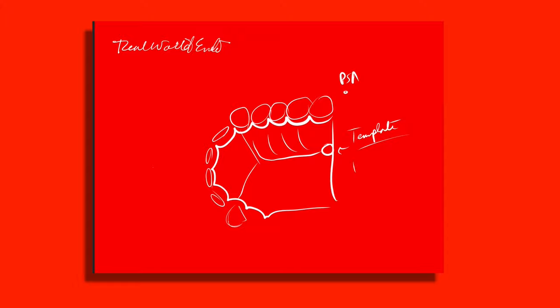The exit of the greater palatine artery is fairly close to the palatal root of the maxillary second molar, making palatal root surgery on that tooth probably not safe. If you do nick the greater palatine artery, you'll get a lot of hemorrhage. It's helpful to fabricate an acrylic template ahead of time — almost like a maxillary denture without the teeth, just the palatal portion — so you can apply pressure to control bleeding if needed.